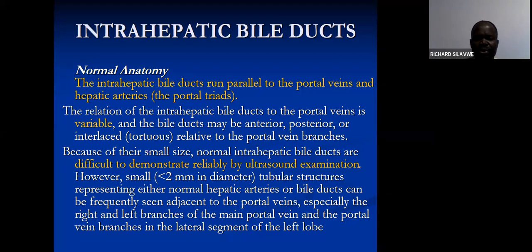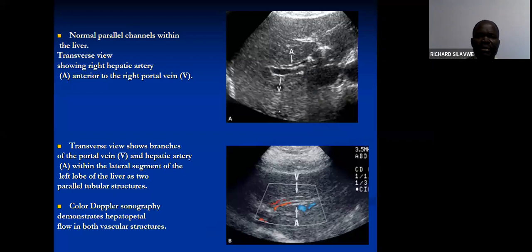Because most of these ducts measure less than 2 millimeters, it's very difficult actually to see them on ultrasound if they are not dilated. These images are showing the duct.